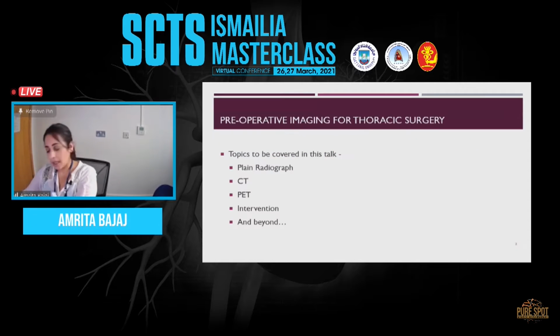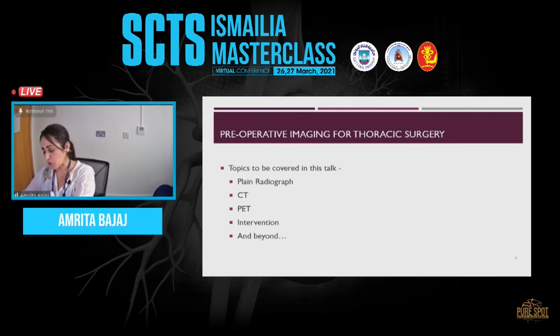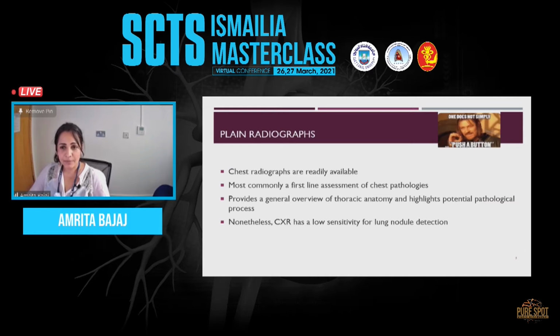My talk is going to be modality based. I'm just going to show you lots and lots of pretty pictures, and we're going to see the different imaging modalities and how radiology plays a role in virtually any imaging, but I'm going to stress mainly on oncology. So plain radiographs, as you know, are most widely available and easily accessible, and you incidentally pick up a lot of nodules. The sensitivity is pretty low, as you know, but because it's so readily available, there you are.